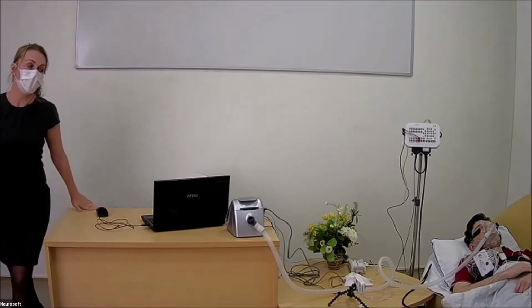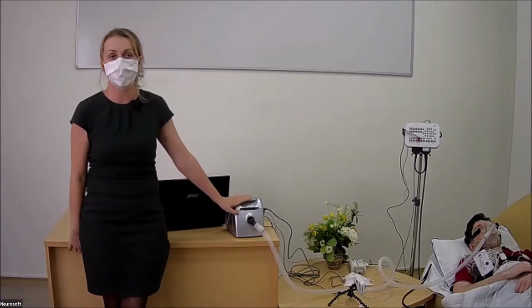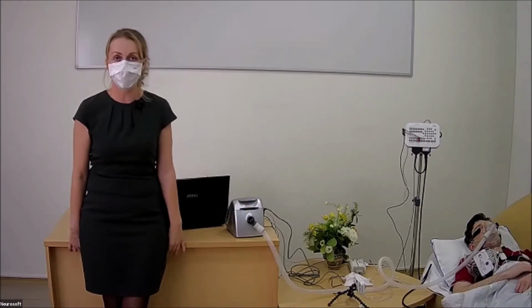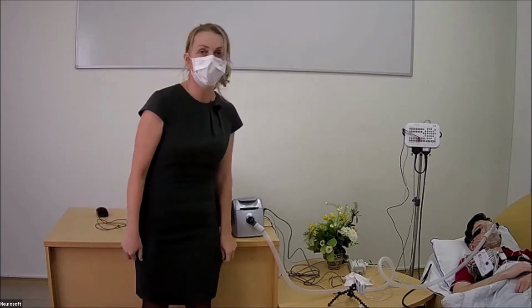So I think that the majority of PAP device manufacturers produce another module. This is a module we sometimes call the PSG module. It may be a polysomnographic unit, different names.